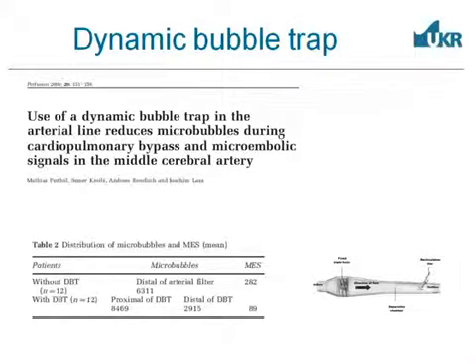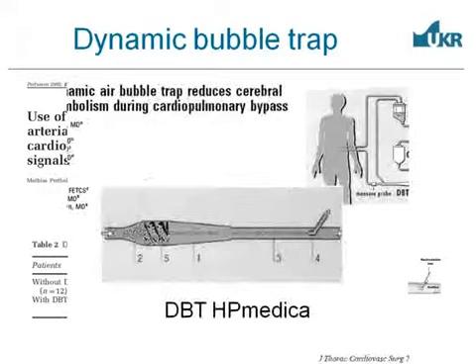A very peculiar system is the so-called dynamic bubble trap. This is a study from Germany by Bevensen, where they used this bubble trap, and the bubbles, as you see in the next slide much better, are collected in the midstream via this triple helix and exit here. They also found quite a reduction of microembolic signals integrating this bubble trap.